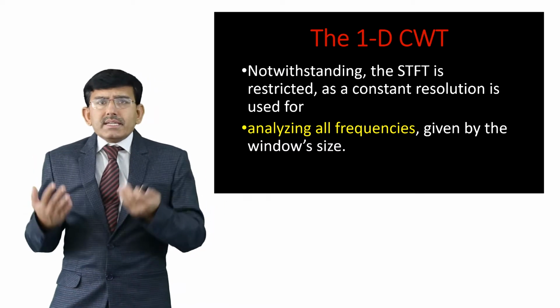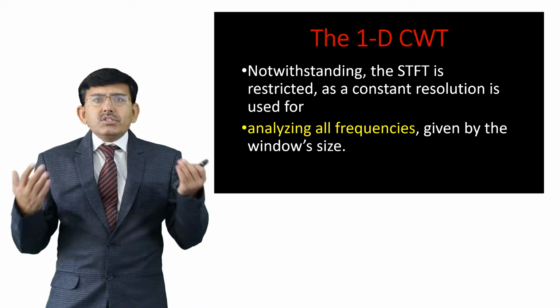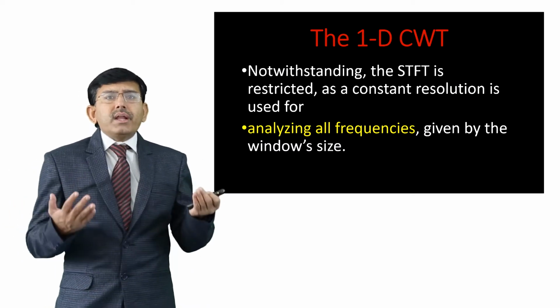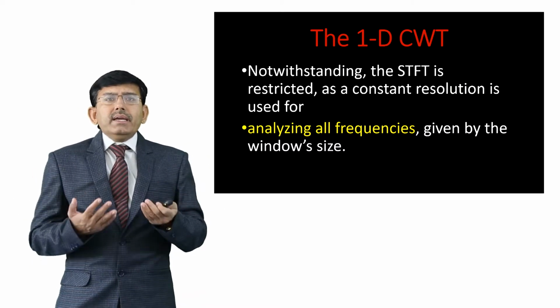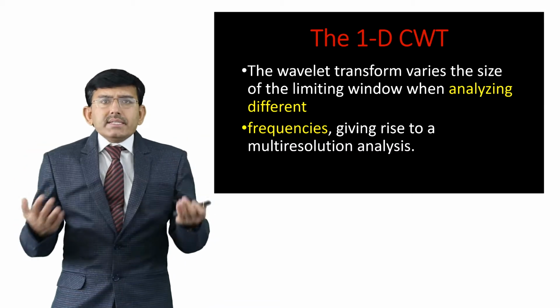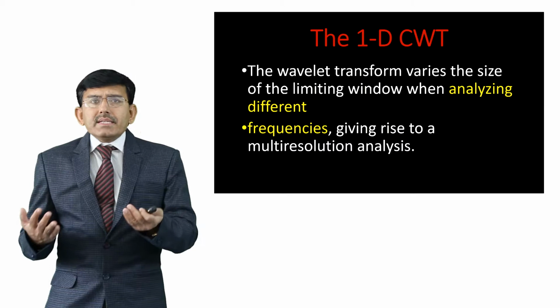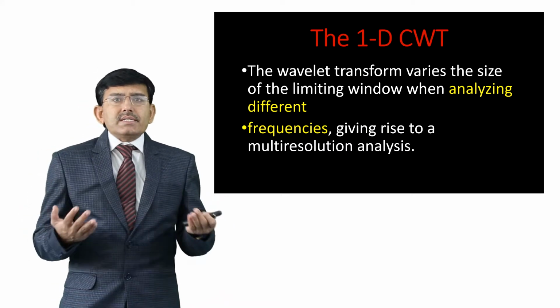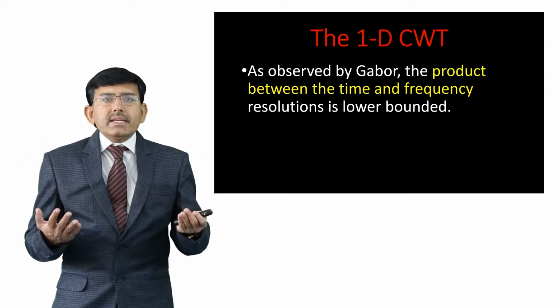Notwithstanding, the STFT is restricted as a constant resolution is used for analyzing all frequencies, given by the window size. The wavelet transform varies the size of the limiting window when analyzing different frequencies, giving rise to a multi-resolution analysis.